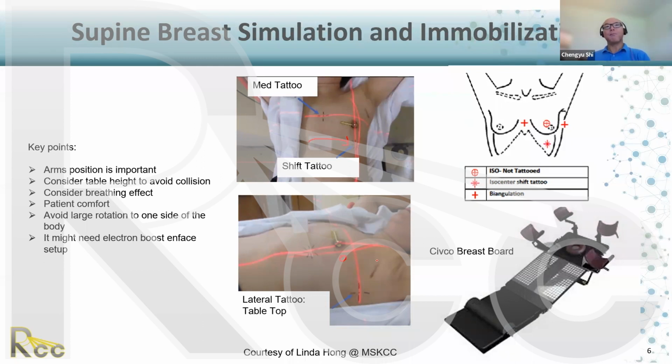And for the planning technology, VMAT and even conformal arcs, it depends. When I treated lung SBRT, I preferred conformal arcs because they are so robust. You will not miss the target, and with the margin expansion it's so reliable.